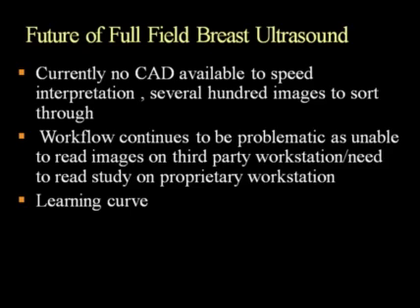And the third thing is there is a learning curve in order to learn how to interpret the automated breast ultrasound images. While it takes a long time early on, you do get better at identifying lesions, at identifying Cooper's ligaments or duct ectasia, but there's definitely a learning curve, like with any other modality.